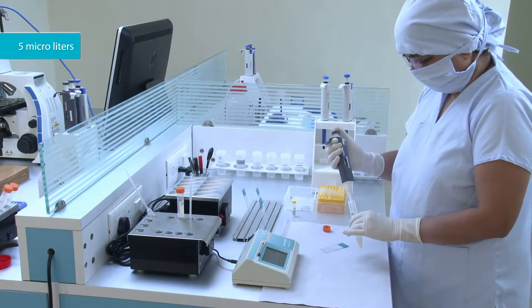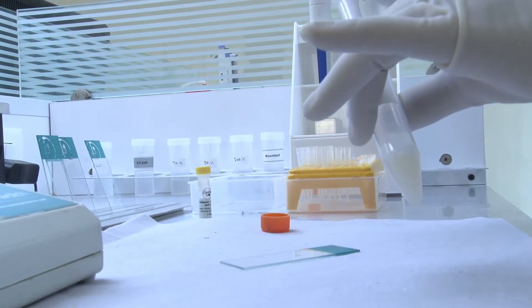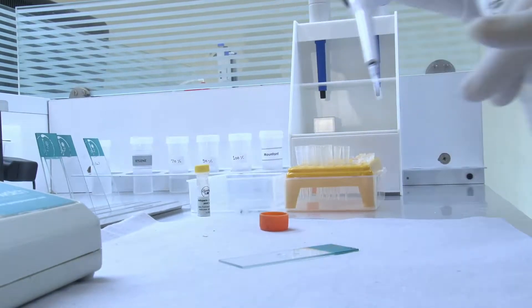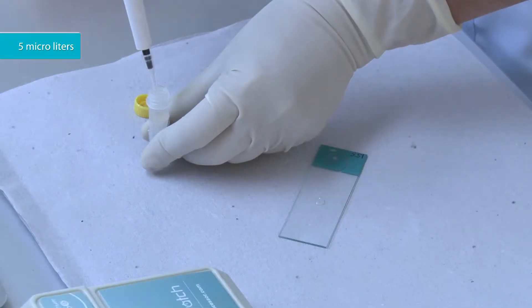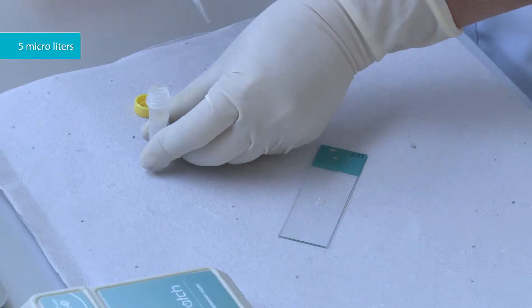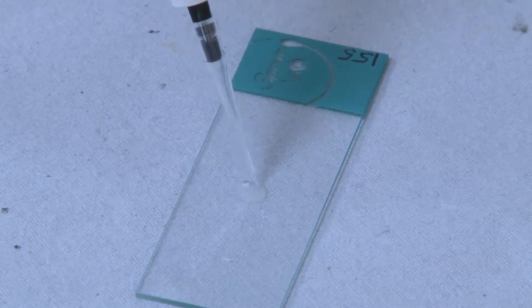Take 5 microliters of liquefied semen and place on the slide. Add 5 microliters of latex particles coated with the anti-human immunoglobulin A antibody on the slide.